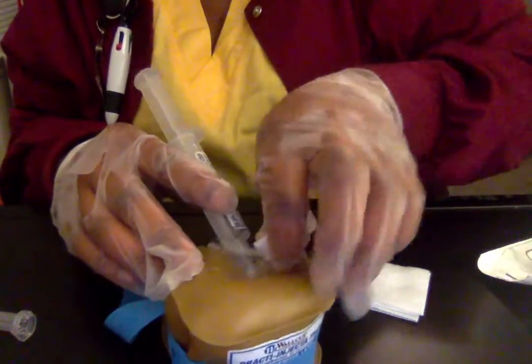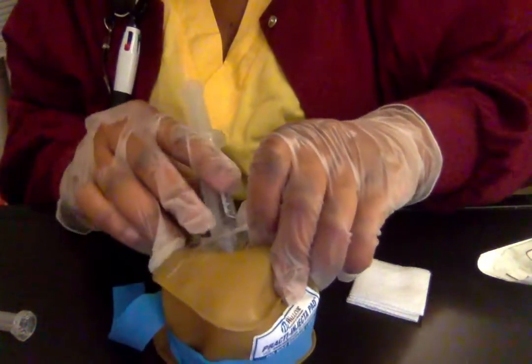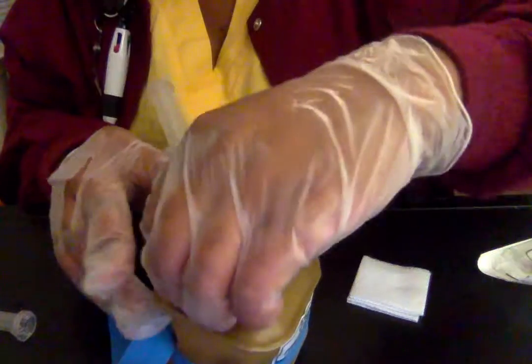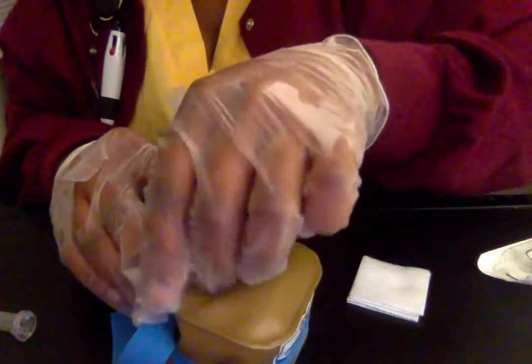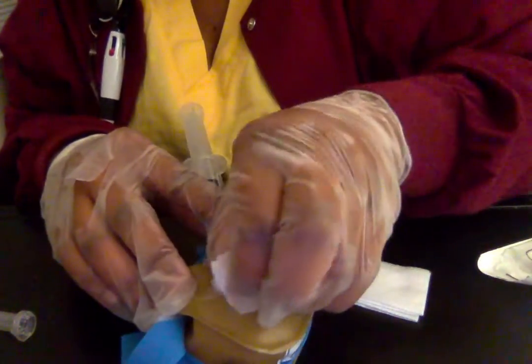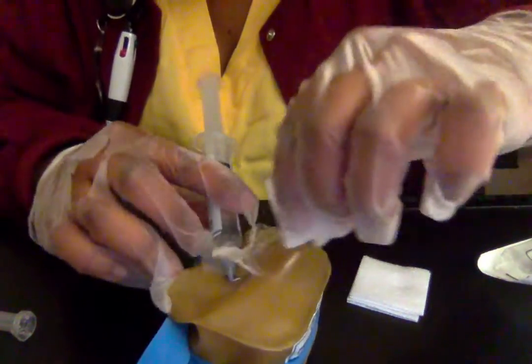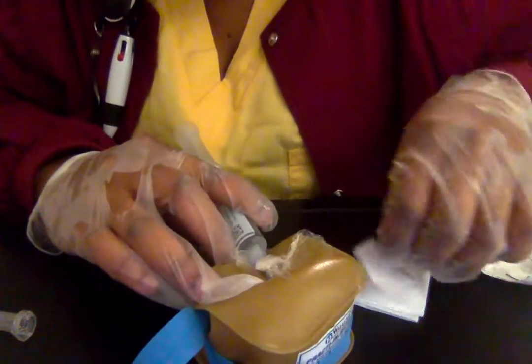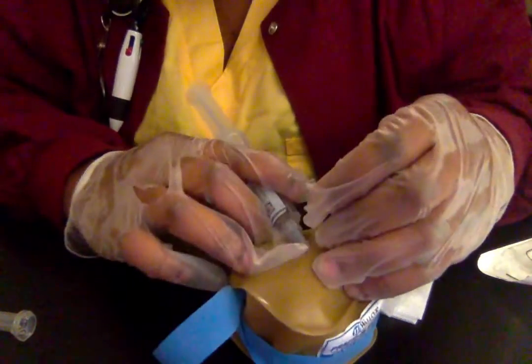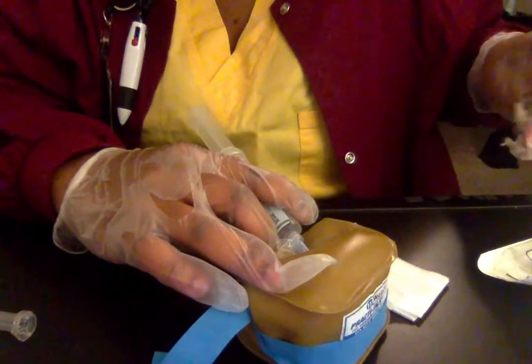Now I'm taking off the Tegaderm just so it won't hurt so much. As I'm taking it down, I'm still going downward so that I don't pull that IV out roughly. Okay, and our catheter is still there, intact. We're going to continue to pull this one off. Just be gentle, especially if they have hair. We want to be a little gentle. So I've got the Tegaderm off.